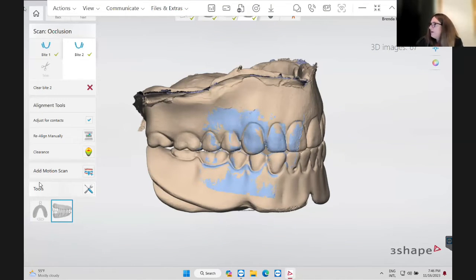So I do have an alginate, so I kind of wanted to go over every bit of scanning, right? So we did almost like a copy denture. We did a reference denture. Yes. I'm going to dump the scan of the upper denture right now, and I'm going to scan an upper impression. And then after that, I will scan a fully edentulous lower.